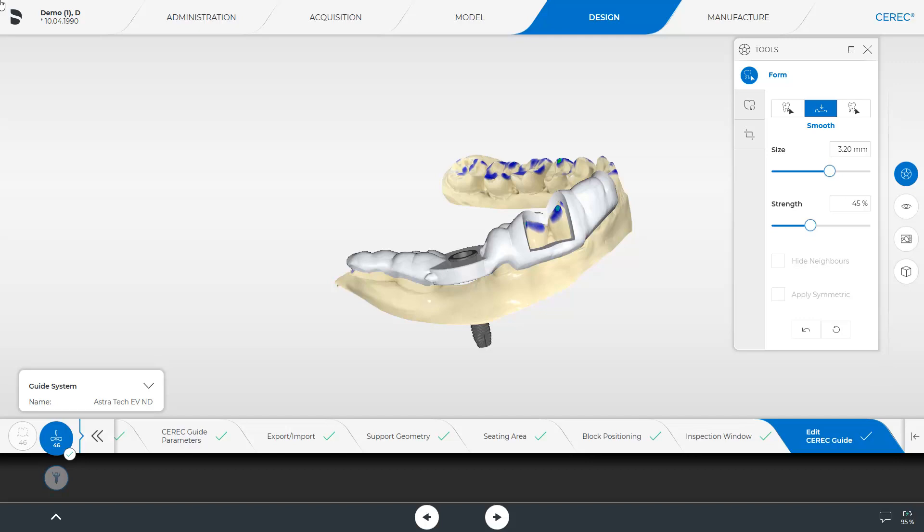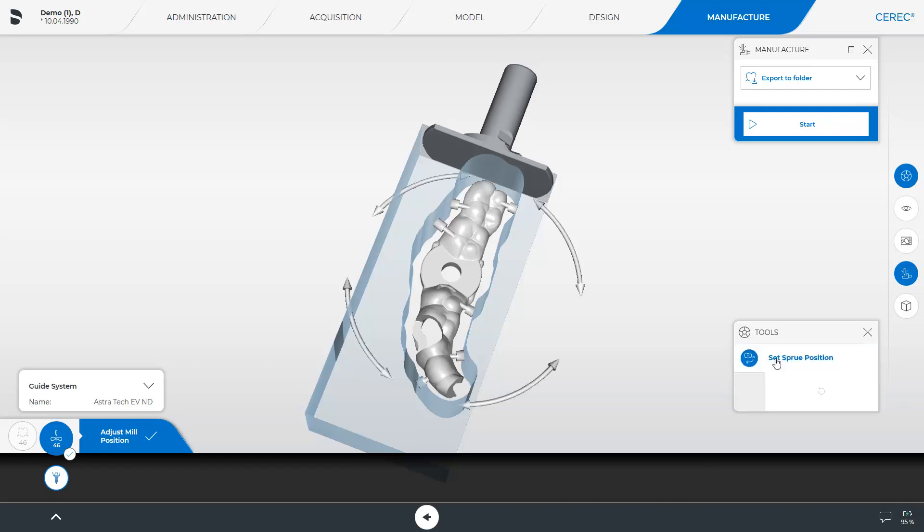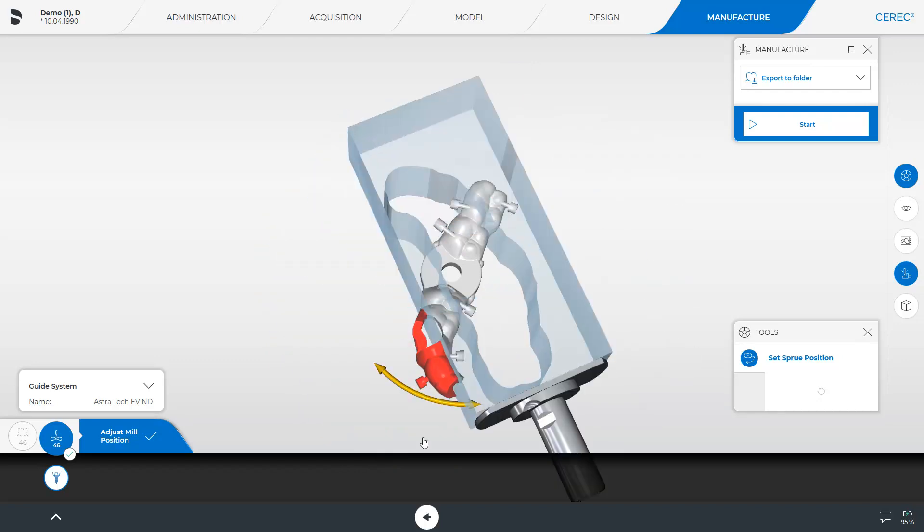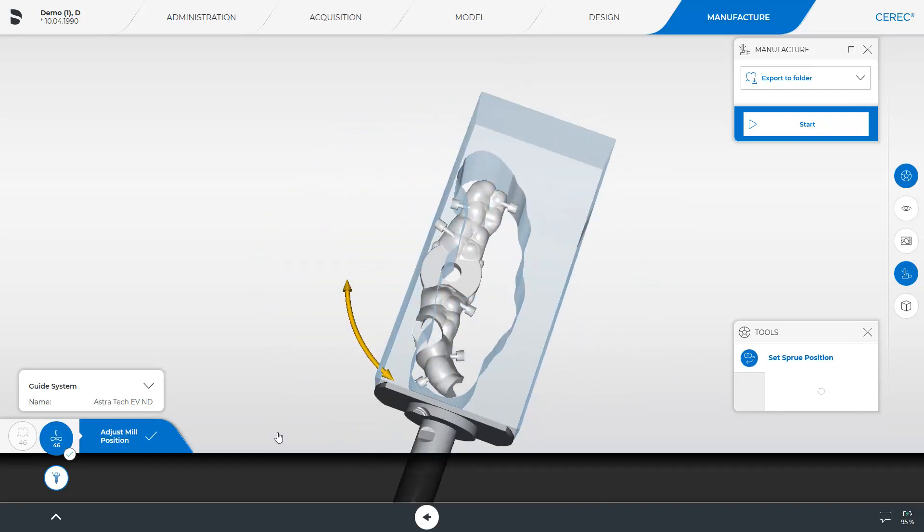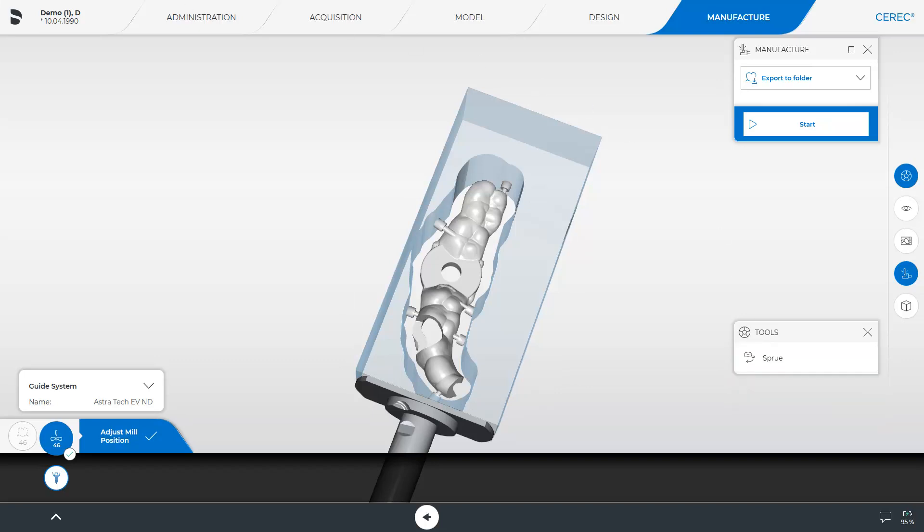Now, we come to the last phase, the manufacture phase. The CEREC software automatically positions the guide within the block. The sprue tool is available in case you want to change the position. To do this, we move the cursor to the block where arrows are displayed in a circle. The guide is now realigned in the block. To avoid further modifications, we deactivate the tool and start manufacturing the guide.